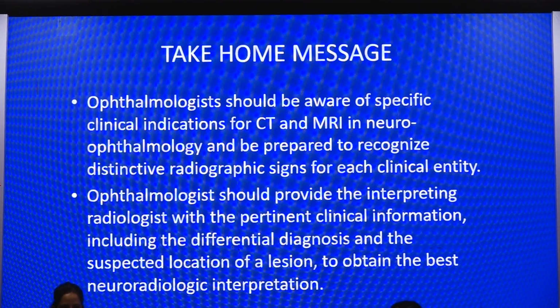And one more thing, the resident should not just keep the film away and just look at the report. Please pick the film, try to identify each and everything.